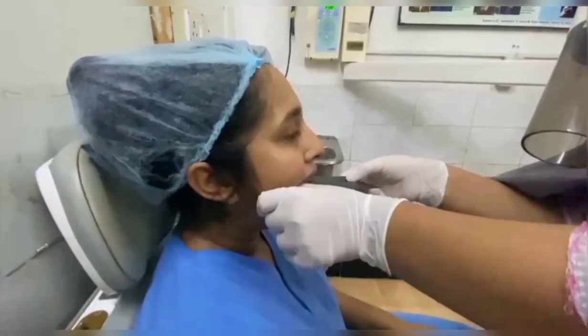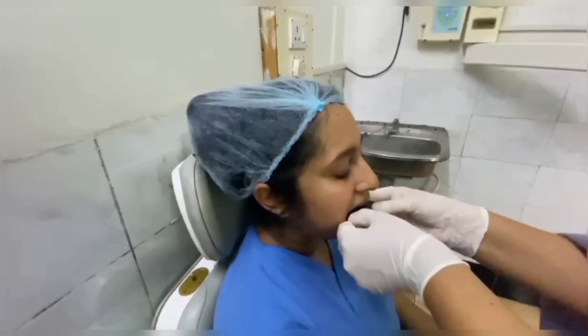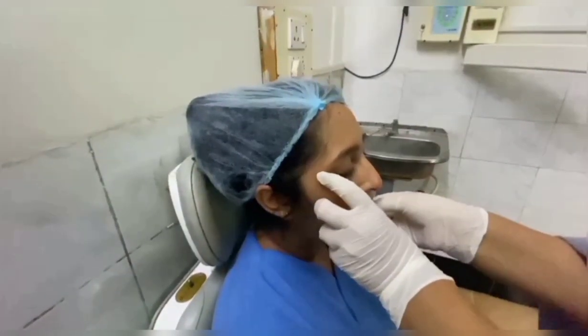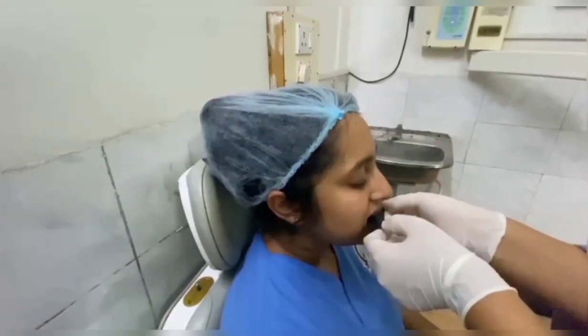Maxillary occlusal radiograph, topographic view, lateral. The film is placed with its long axis parallel to the sagittal plane, and it is pushed towards the side of interest. The lateral border should be positioned parallel to the buccal surfaces of the posterior teeth. The film is stabilized when the patient gently bites on the surface of the film.